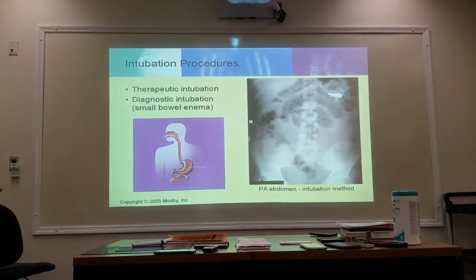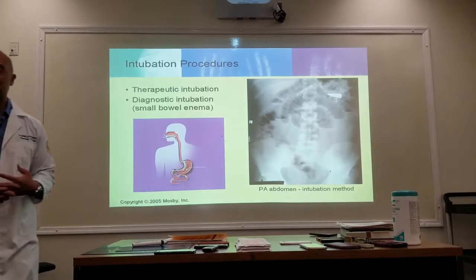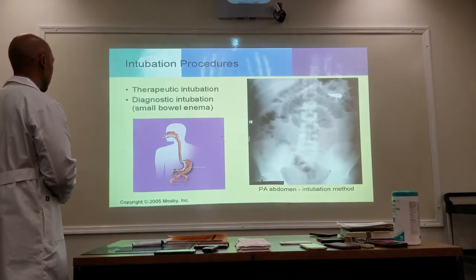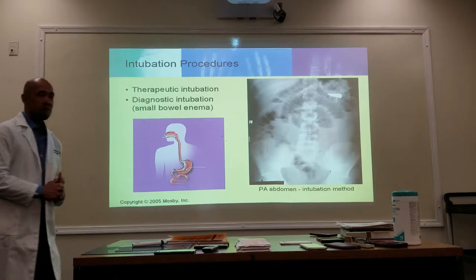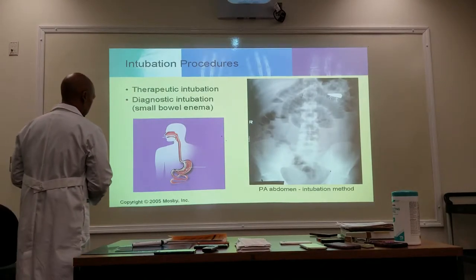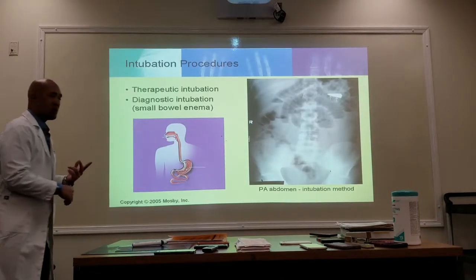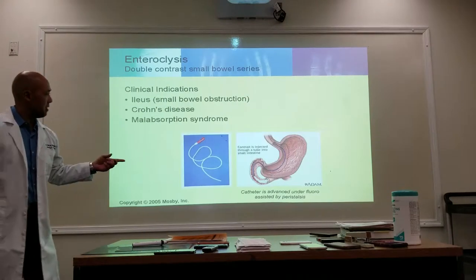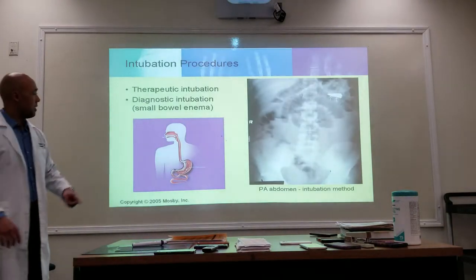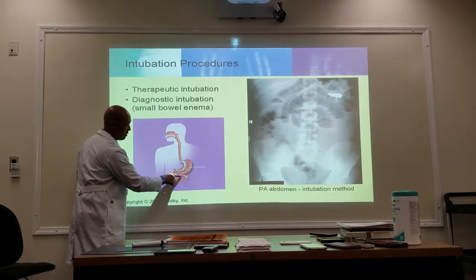The intubation process, also known as a small bowel enema, uses either a nasogastric tube or a nasoenteric tube, NG or NE tubes, down the esophagus, into the stomach, and around the bowel. This is a little bit different. They try to put this catheter further down into the bowel. The enteroclysis catheter sits around the duodenum, but the NG tube for intubation goes a little further past the first segment and into the second segment, the jejunum. So it's around the duodenal jejunal segment.